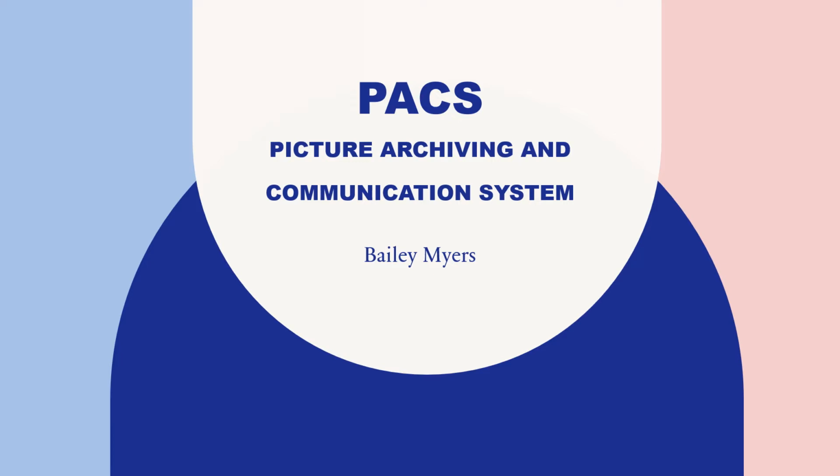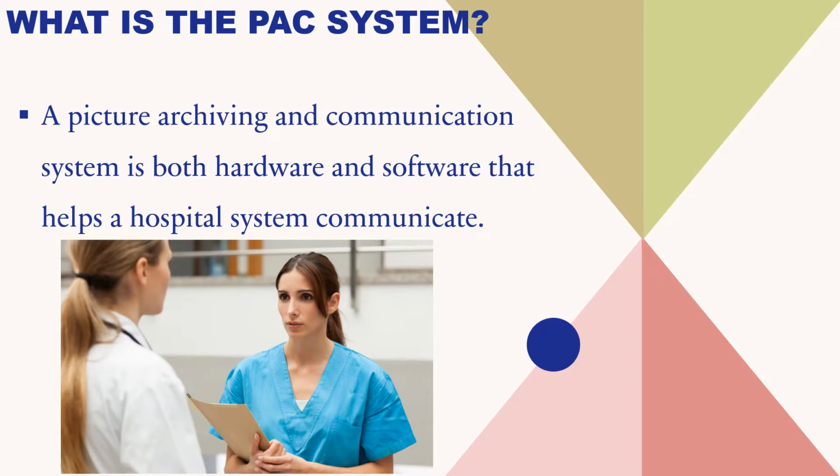showing you a presentation on the Picture Archiving Communication System, otherwise known as the PAC system. The PAC system is comprised of both hardware and software that helps a hospital communicate, as well as send images, amongst a couple other things, but its main job is to help communicate and send information safely.